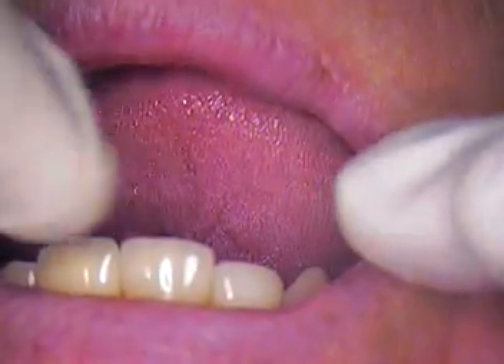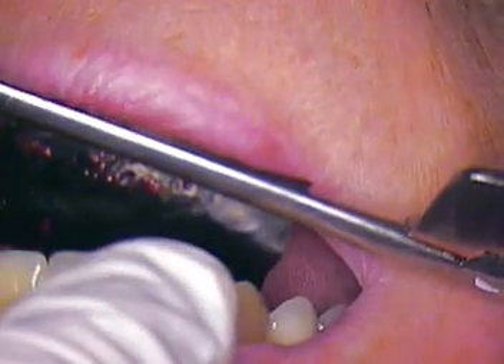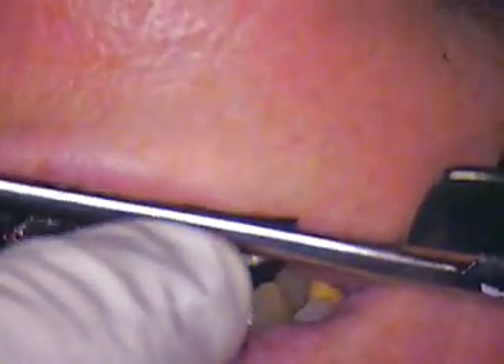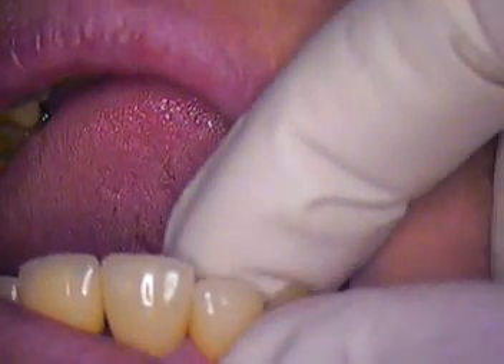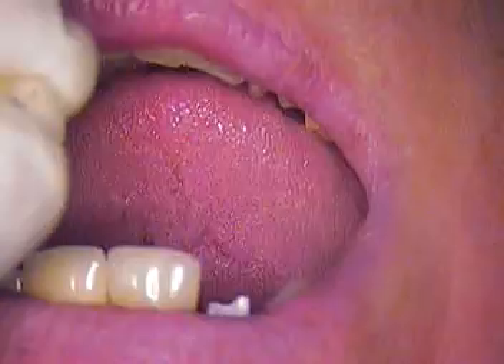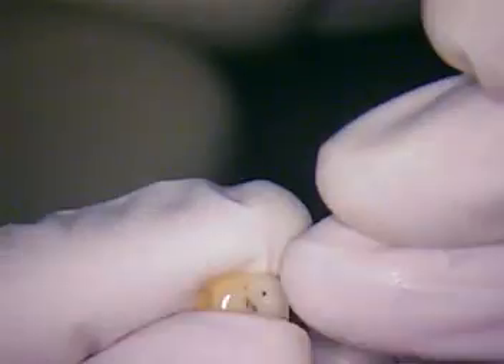Now we just have to worry about your bite, so let's mark that. Go ahead and tap for me — tap, tap. And obviously hitting that first. Maybe just three times up and down and I'll adjust it. We're going to adjust it and then I'm going to etch your zirconia. I'm also going to etch the crown so we can get a nice bond in here. And then once we do that, we'll be finished.